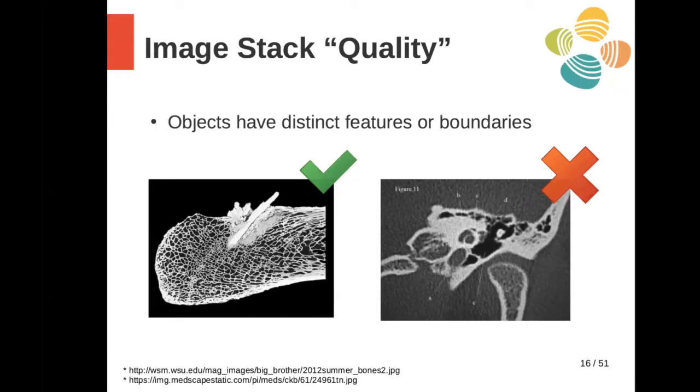We may be able to use things like watershed segmentation techniques, though, because the outer part of the bone is well discriminated. We could combine a variety of techniques: after you've done your classification into dense bone and not dense bone, then with a little bit more training, into body versus inner bone, and then get out the entire object as we conceive it as a bone.